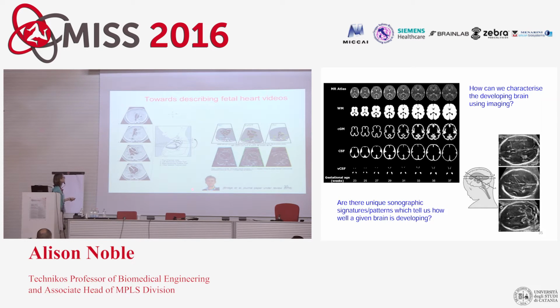And what Chris developed was a very nice way of taking three of the views shown here, four-chamber, the left ventricular outflow tract, and the three-vessel view, and translating that into a Bayesian-based method of being able to estimate which plane you're in and which phase of the heart cycle you're in as a cardiologist moves the probe.